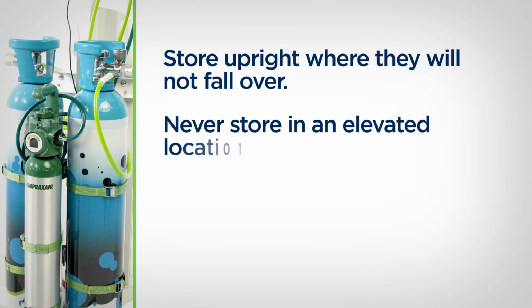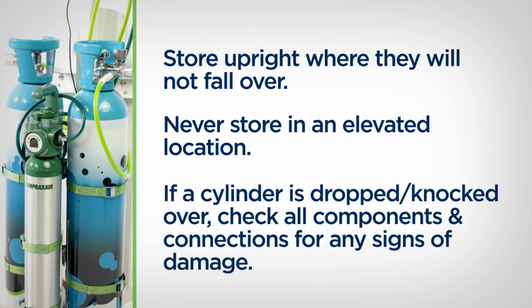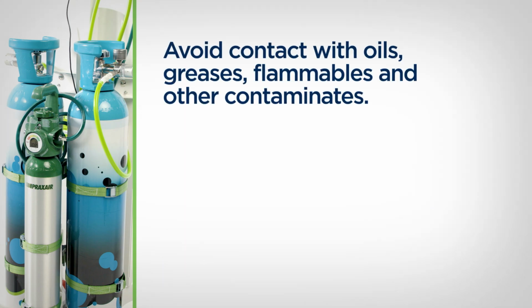Never store a cylinder in an elevated location because a fall could seriously damage the valve or the cylinder. If a cylinder is dropped or knocked over, check that components are not damaged and that the system connections remain secure. Always keep the cylinders and valves free from contact with oils, greases, flammables, and other contaminants.